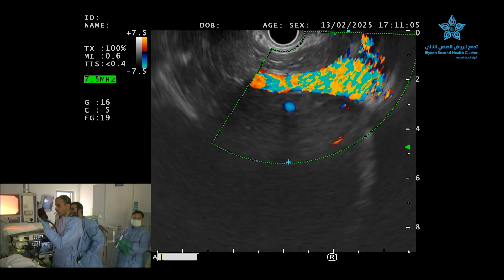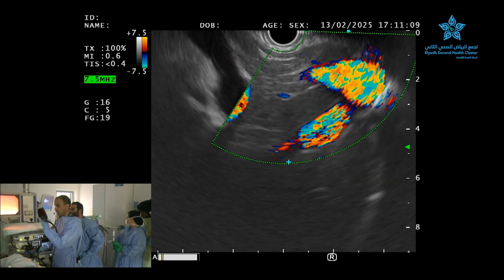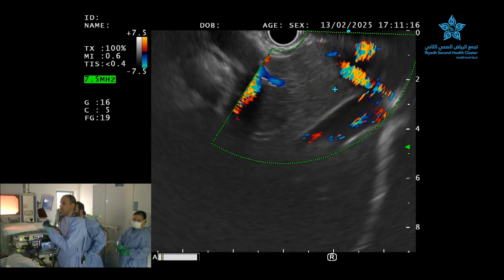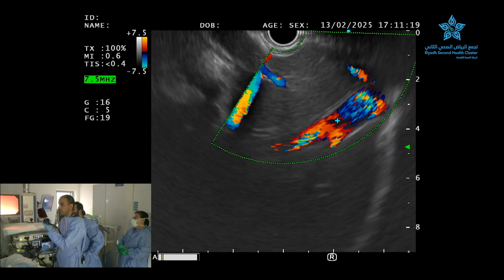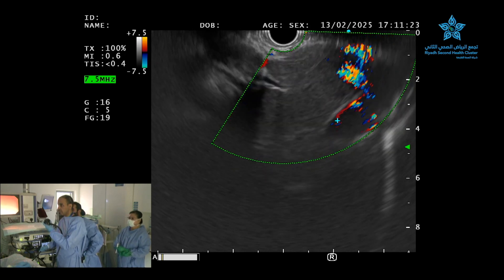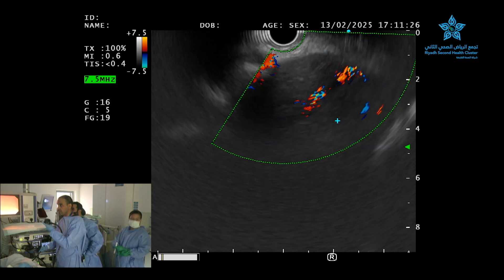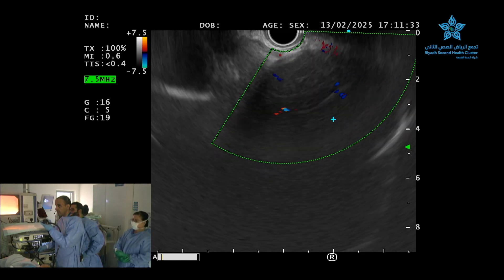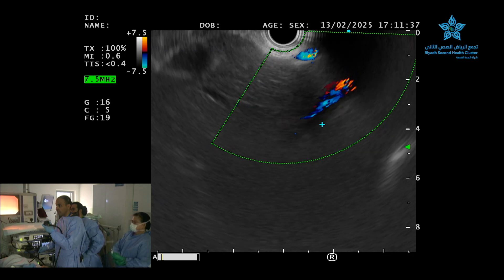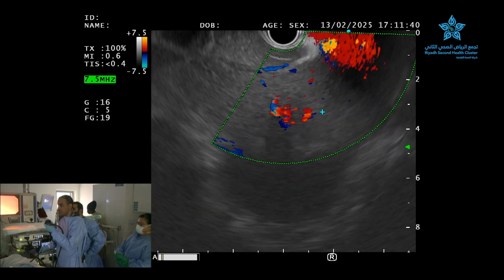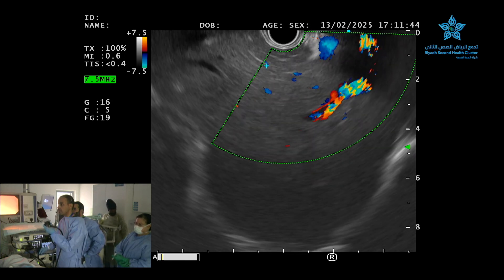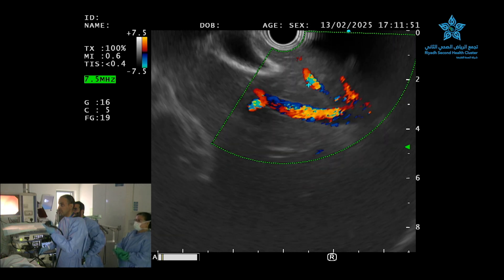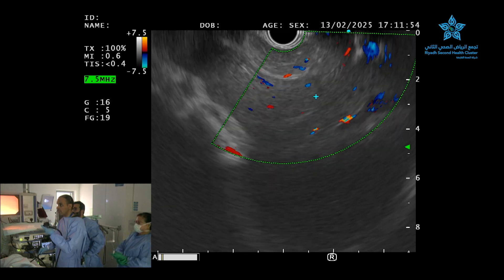If we keep going counterclockwise, we go from the most right side where we can see the IVC and the right hepatic vein going into the middle hepatic vein and the left hepatic vein. Now Nawaf will go more counterclockwise, trying to find the best segment to put a needle where there is no vasculature in the way. We can see the middle hepatic vein going counterclockwise — segment one with the cursor close to the transducer. If we keep going left, we will see the left hepatic vein separating segment two from segment three.